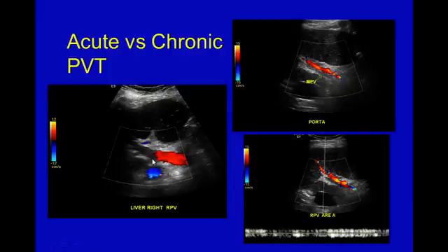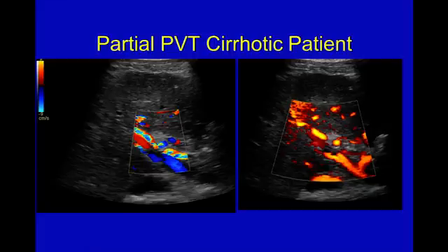Now, acute portal vein thrombosis will actually distend the vessel a little bit, and that's similar to venous thrombosis anywhere. You can see as this becomes more chronic, the main portal vein gets smaller and a collateral may form alongside of it, as you can see here. This also could represent the hepatic artery, so you have to sample it to be sure of which vessel is actually present. Just another quick reminder, you can see here, here's the hepatic artery with some aliasing because we're sampling at very, very low scale here to pick up the portal vein flow.